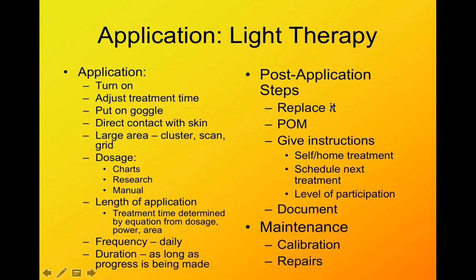So our post steps: replace the laser, do your patient-oriented measure, so figure out how they're doing after the treatment. Give your home instructions, so any self-treatments, schedule your next treatment, and their level of participation. Remind them to look for that little bit of a sunburn if you had concerns about their photosensitivity, and document.